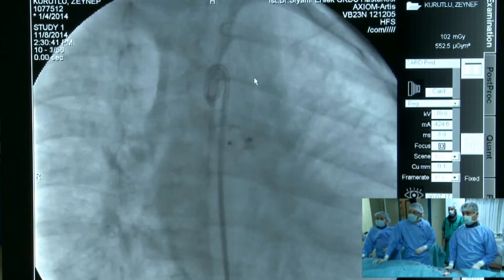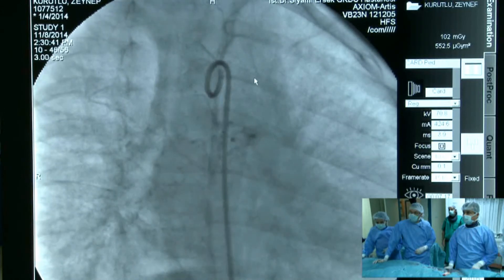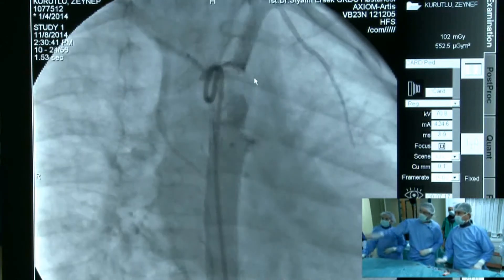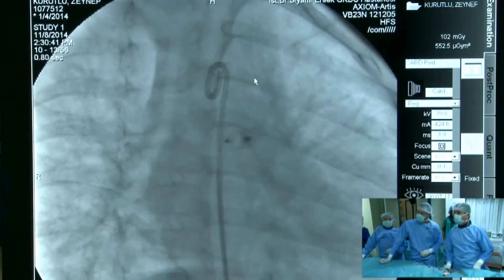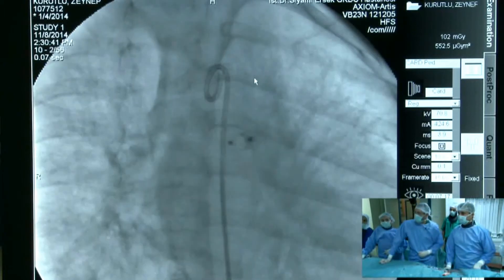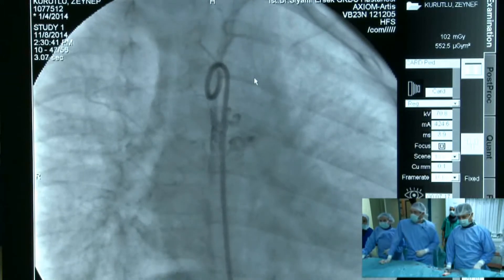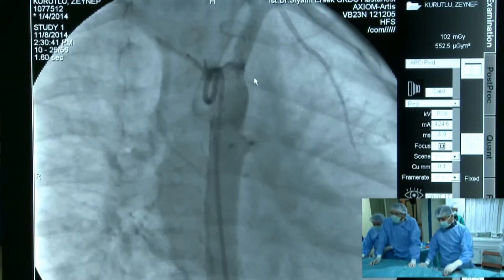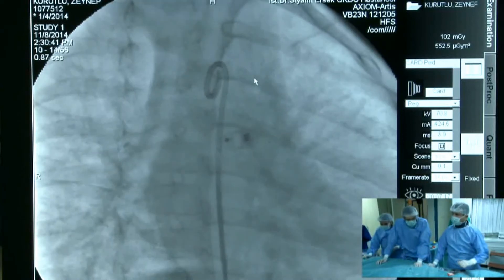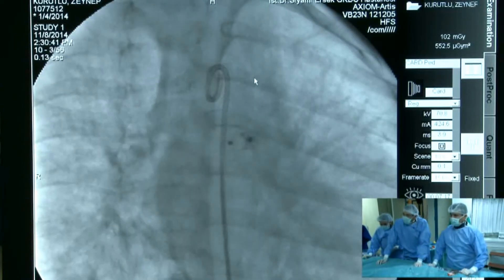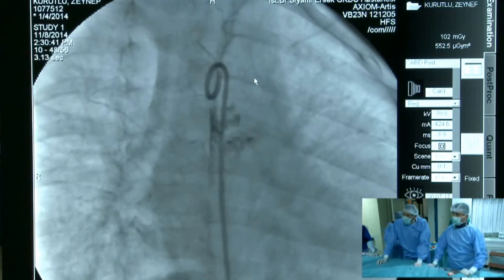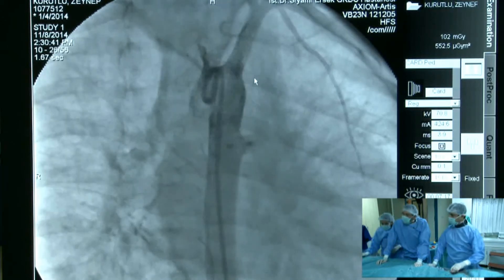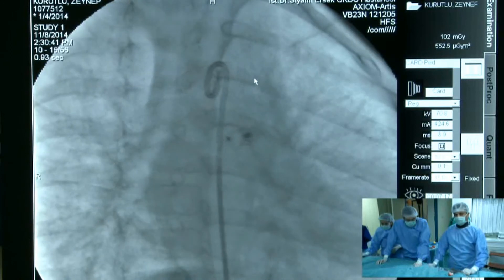Metin, you showed us a nice result. There is total occlusion and the lumen of the aorta appears not to be obstructed by the device. You measured pressures above and below the device — is there any pressure gradient? There is no pressure gradient. We measured before and after device release: 104 ascending and 104 descending — identical. That means definitely no pressure gradient.